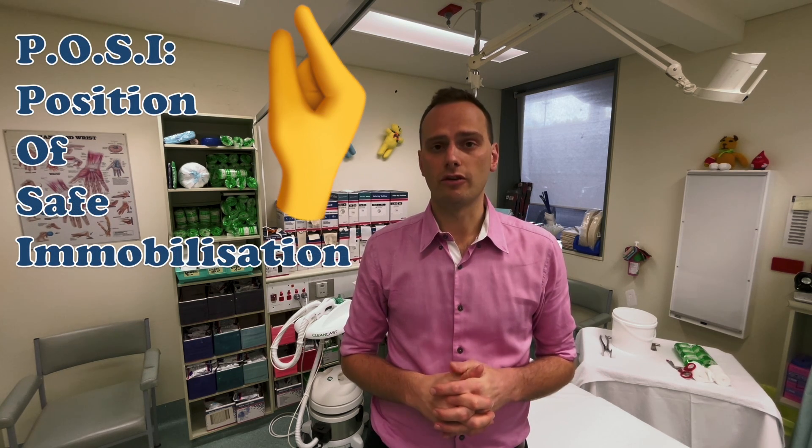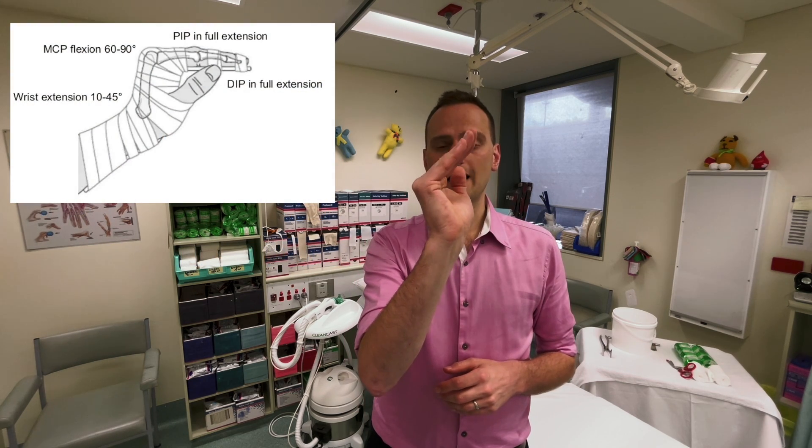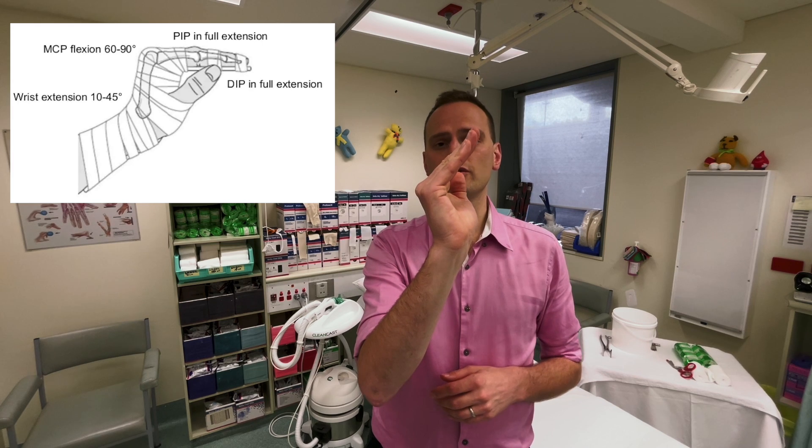For hands and fingers, the most common cast is the position of safe immobilization, known as the POSI. It's typically wrist extension, metacarpophalangeal flexion, and interphalangeal joint extension. This places the ligaments of each joint in a position of tension to reduce contractures and stiffness after the casting period. That's a summary of the upper limb splints and slabs — we'll now work down towards the toes.